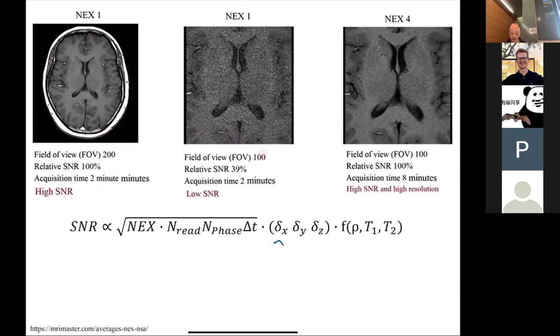That means each of these dimensions goes down by a factor of a half, so the SNR would be reduced by a factor of 4, because I'm reducing the voxel size. To get that back, they increased their NEX to 4. Now in this case, that should only get you a factor of 2. So maybe they only reduced FOV in one direction, although they did it in two.